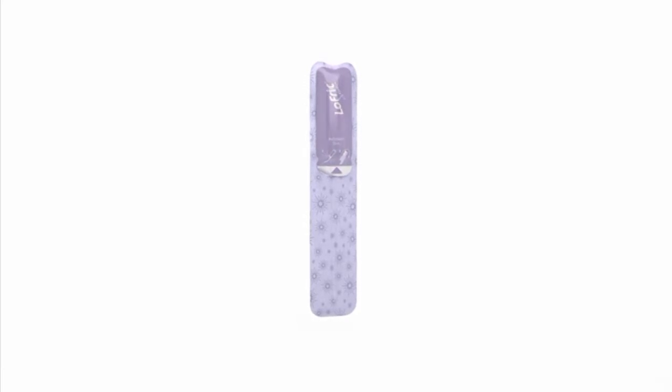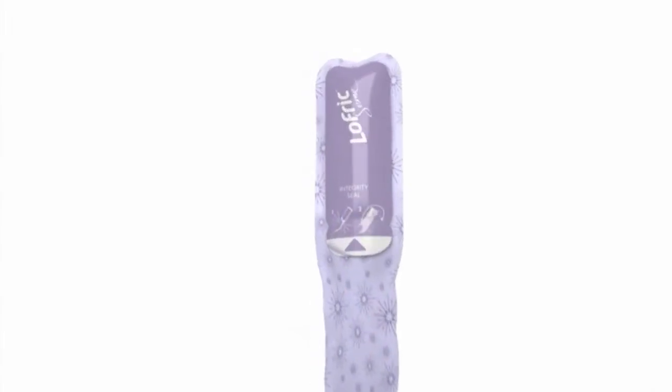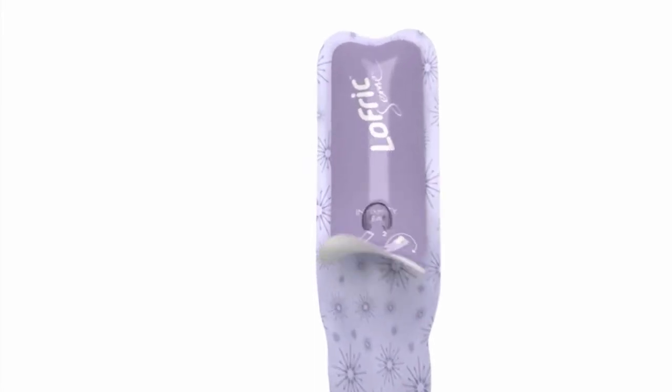To activate Lofric Sense give it a gentle squeeze right here. That will lubricate the special non-friction coating on the tube so it's more comfortable. Peel the top half open and remove the catheter, and set the package aside until you're done.